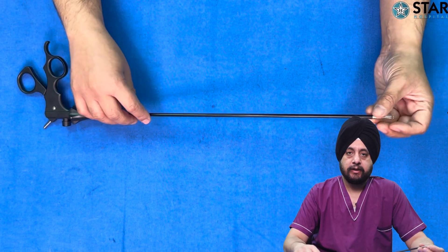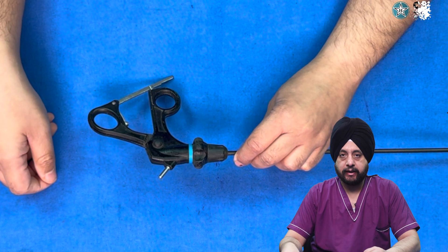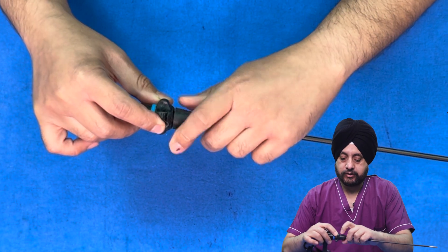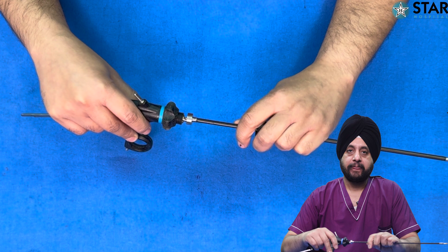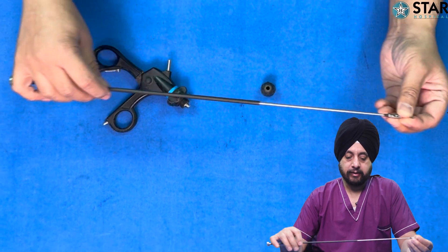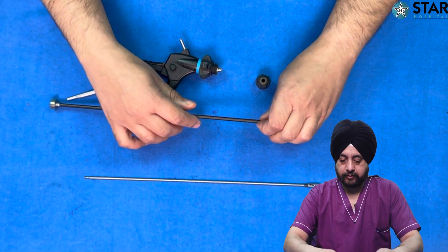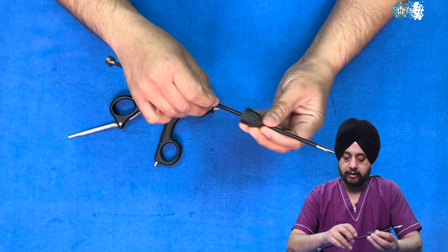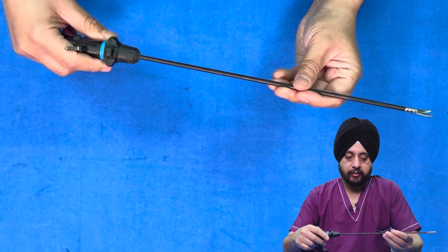This is a different type of handle which has a locking mechanism so you can lock it and retain the position. This part is also different — there is no clickable mechanism, so you need to rotate this joint and then open the grip to disengage it and bring it out. Again this part can be taken out, the insert can be removed — this is how you disassemble the whole instrument, wash it well, and then reassemble. Insert it, tighten the screw, place this part over here and engage it, then tighten it. The rest of the parts are similar: this is the shaft, this is the tip, this part is for rotation, and this is for monopolar cautery.